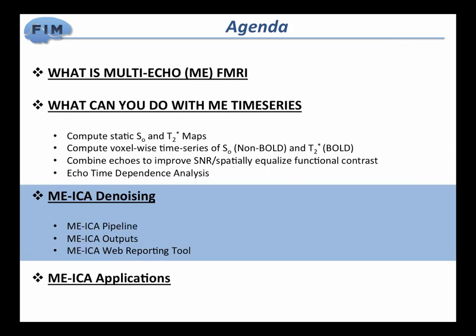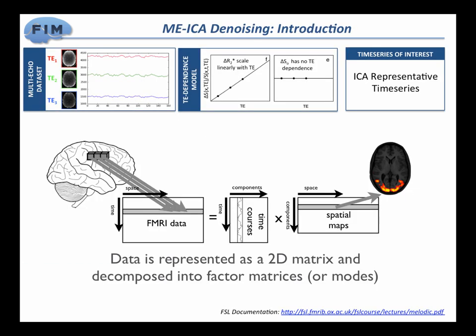So, MEICA. Disclaimer first. I'm going to go over some of the details of it, but MEICA has been evolving in the last few years. Prantik has been taking care of it, and most likely what I'm going to explain here is not the latest version of MEICA, okay? If you're going to be using the latest version, which I think is 3.2, some of the things might actually differ. The generic concepts are correct, but if you see some inconsistencies, just be aware that things have evolved. And we here are trying to develop other alternatives of doing things. So I'm going to try to go over the generic concepts that apply to everything, but there might be some discrepancies.